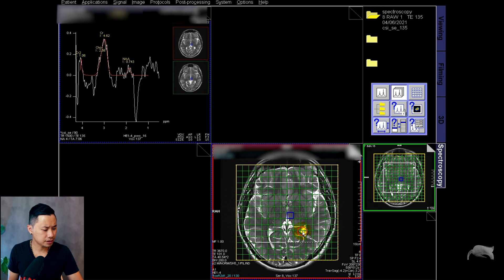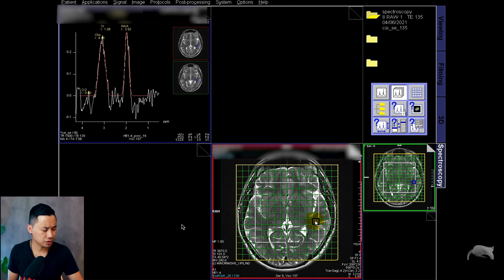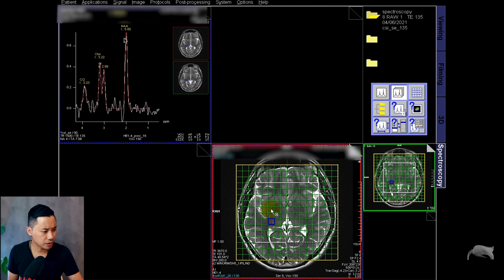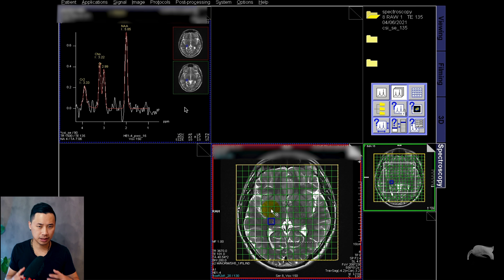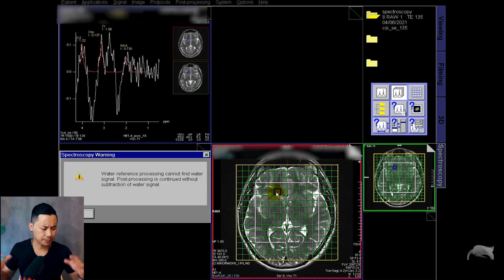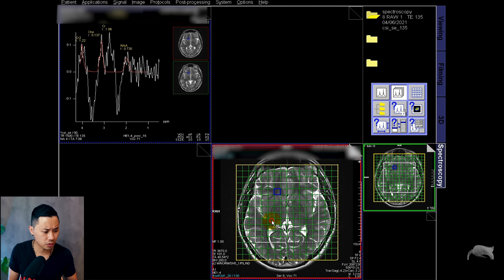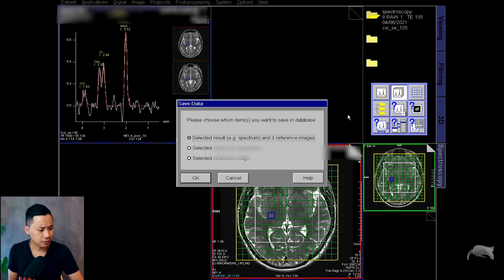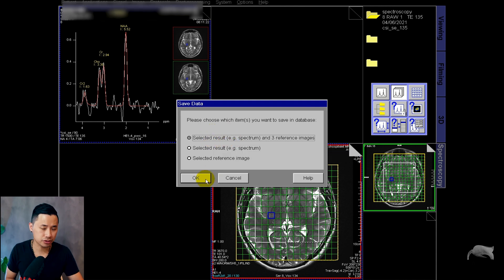You open that preset and you can see the voxel here is not good at all — a lot of noise. I can push around and check different voxels. This one seems okay — you can see the peak is upward, which is a sign that everything is fine and there's no pathology. If the peak goes downward, it could be a sign of pathology — just something to keep in mind. You can see it has a lot of bad boxes because I made the voxel really big and had bad shimming — shimming is extremely important. To save different voxels, push this save button and select spectrum and three reference images, then push OK on each box you want to save.